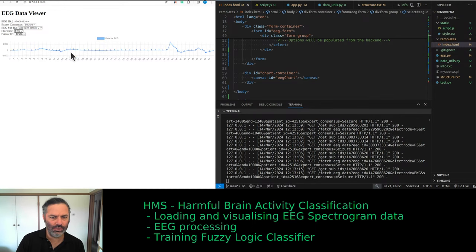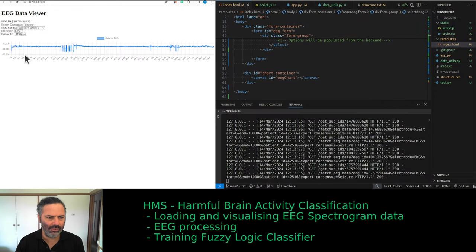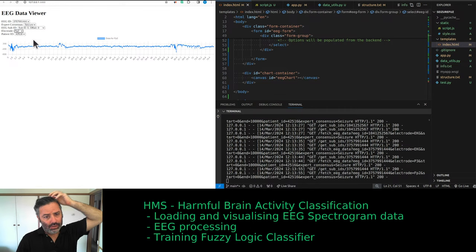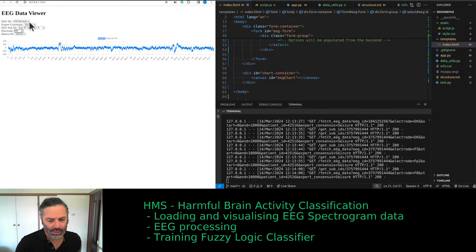I'm not sure of one way to go about seeing if you actually have ECG. Sometimes the ECG electrode could be off, but everything else might be working correctly. That is possible. However, if you see a very noisy ECG like this, this is probably a strong indication that other things are very wrong in this recording. So if you see stuff like this in your ECG channel, it's highly likely that if you look at the EEG recordings, you will see high noise there as well, which is indicative of problems. So we might start filtering this data that way.